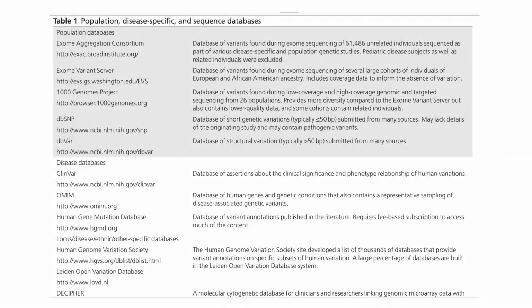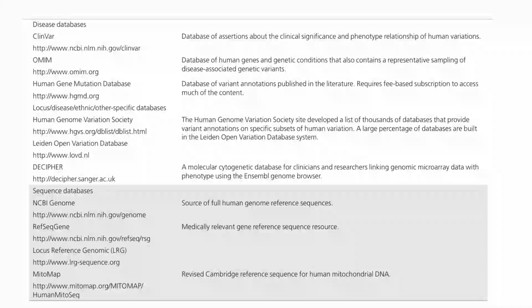They are important because once you eliminate the common polymorphisms, then when you are trying to sieve the variants which are extremely rare, you just don't identify the variant. You go and see where this mutation lies in the protein structure. Has it been documented in literature that it is already causing the disease or not? This information is what you will get from the disease databases. This is all part of clinical reporting. It will be reiterated in my last 3-4 slides, and so on and so forth.